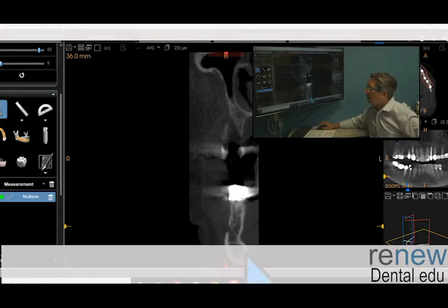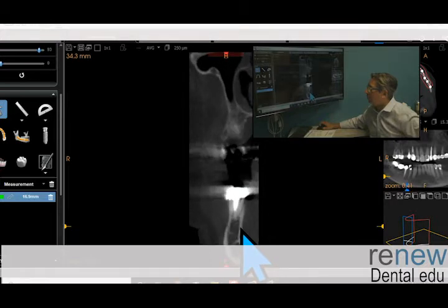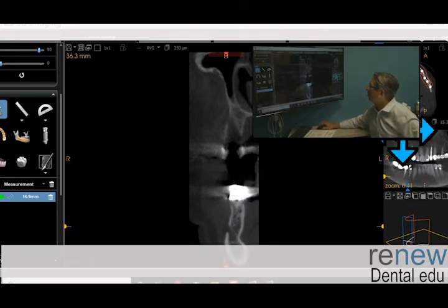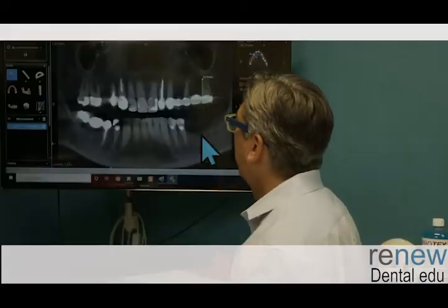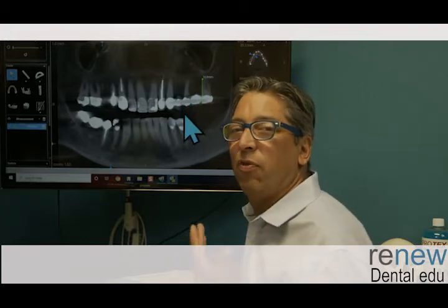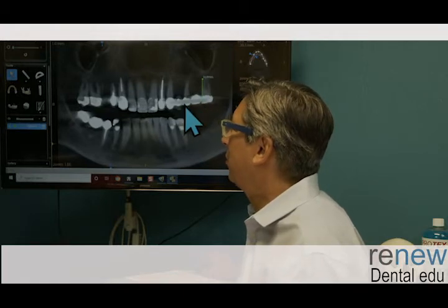Look at how the bottom constriction is. If she loses any teeth on the bottom, you for sure need to graft and make sure you maintain that width distance because she just doesn't have anything going on there. So the upper is where we've got to worry about. Thank God we're not worrying about the bottom, and that makes life a little bit easier. Unfortunately, this bottom area is a site that is not valid anymore, but it helps this situation for the cosmetic reasons that she wants, and I don't really have that much of a problem.